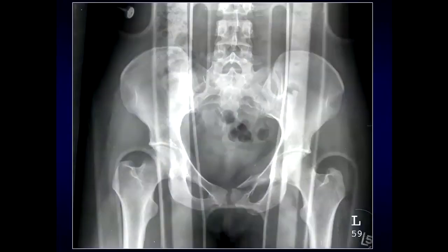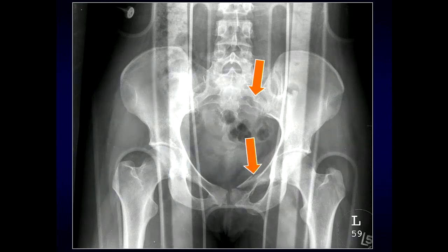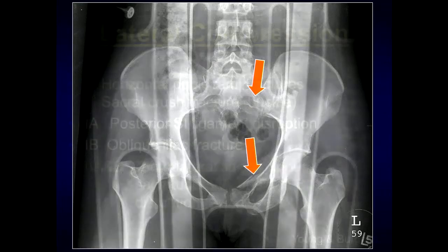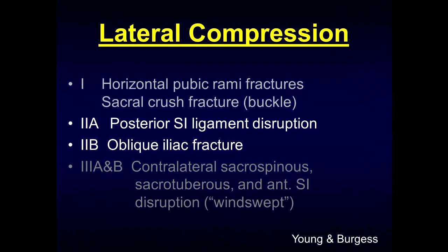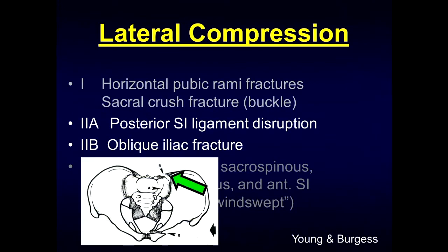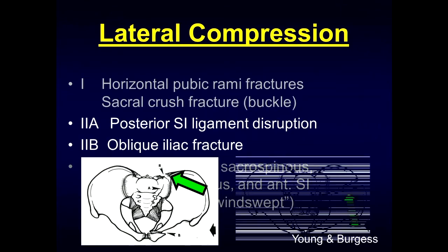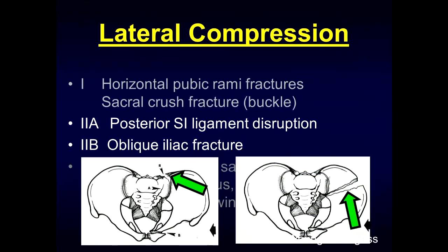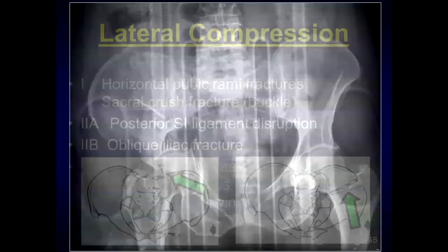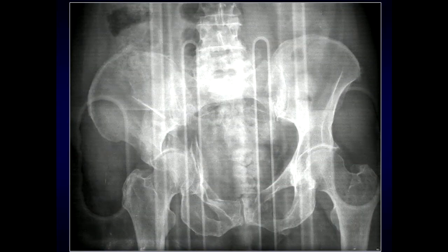On the AP view of the pelvis, we can see there's disruption of those normal sacral arcs as well as the rami fractures. Type 2A involves posterior SI joint ligament disruption, and type 2B involves an oblique iliac wing fracture. On radiographs, we can see the iliac wing fracture, as well as a comminuted fracture of the acetabulum and bilateral rami fractures.